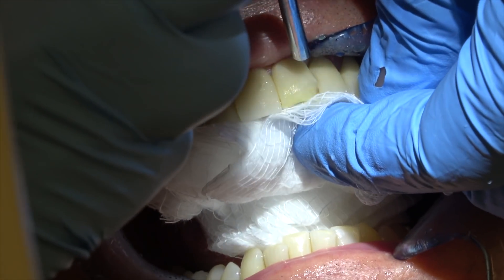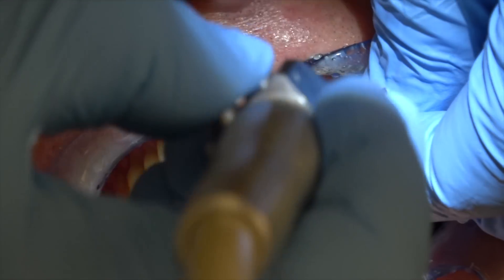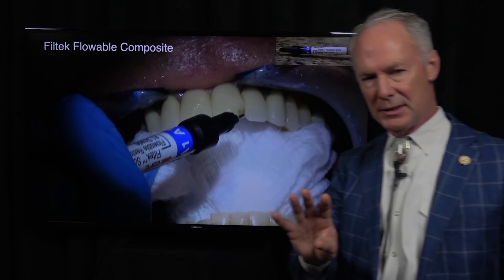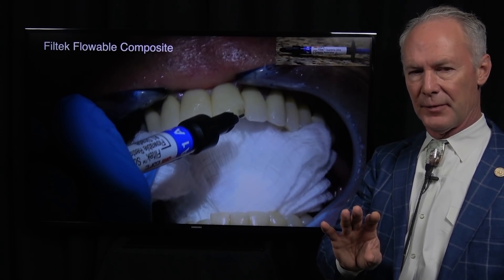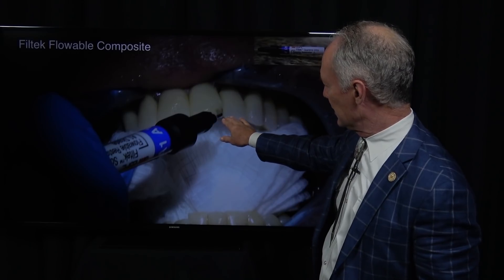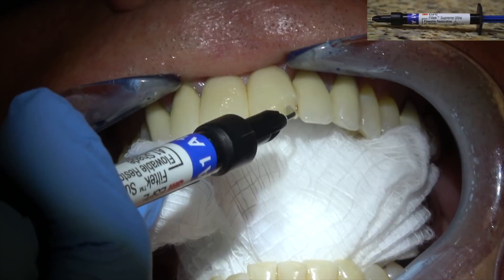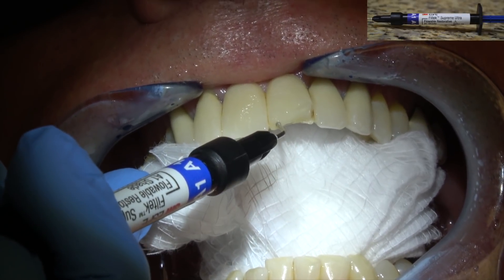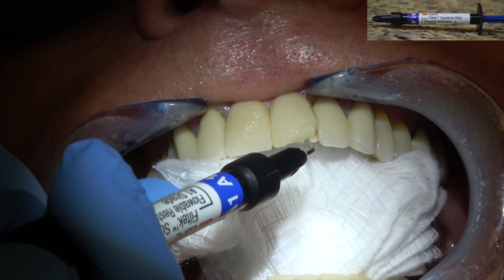Then I'm going to place the primer adhesive copiously, blow that off, then cure the primer adhesive — this is very important — for about five seconds. Next comes the filled resin: I'm placing flowable composite in small increments, and between each increment I'm curing it for 20 seconds.